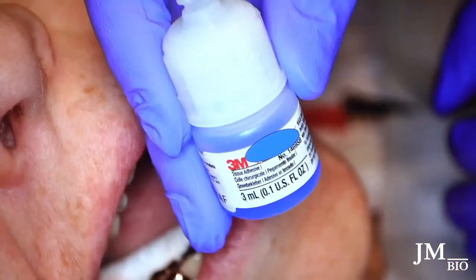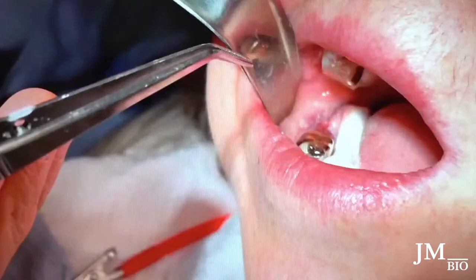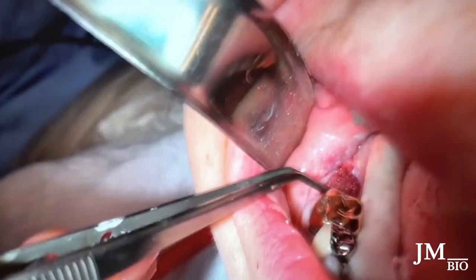It's Dermabond — I use a little carrier and put drops in it. I have a wet cotton pellet on hand and dab it on top. Once it's on there, it solidifies immediately and becomes very hard. It creates a barrier seal.